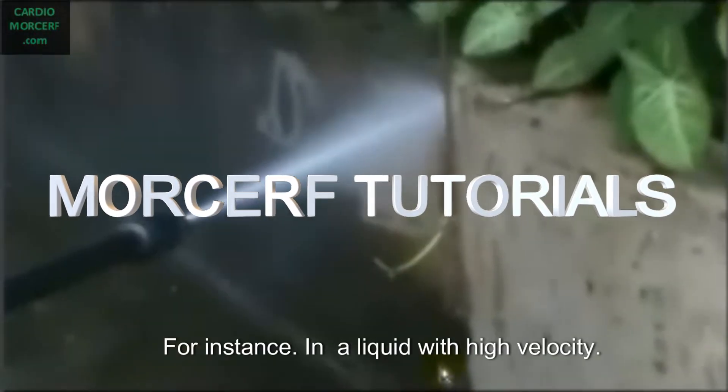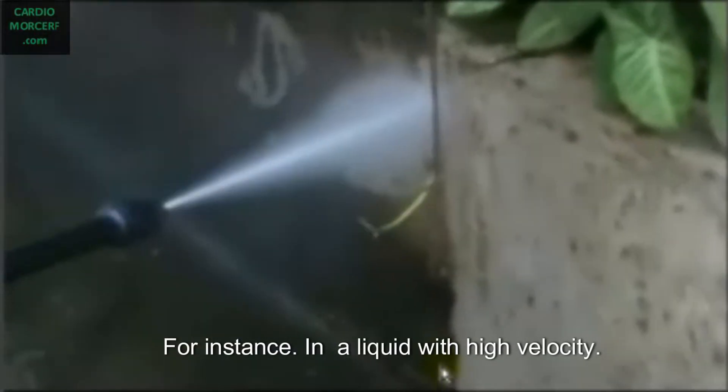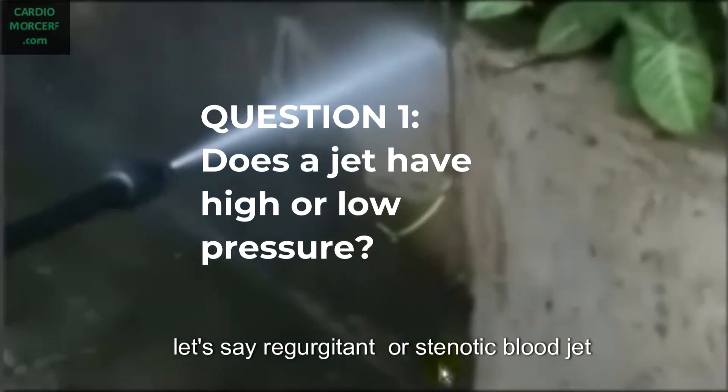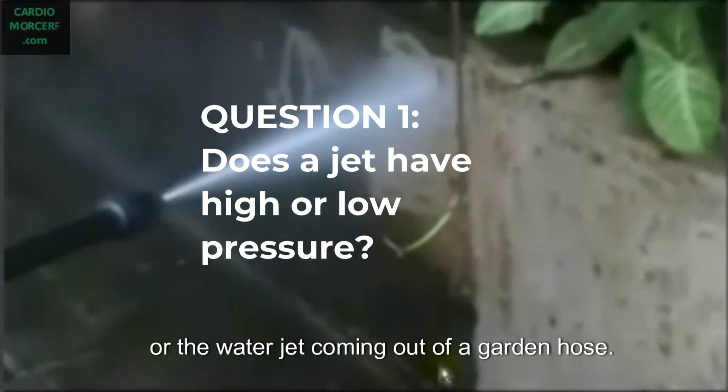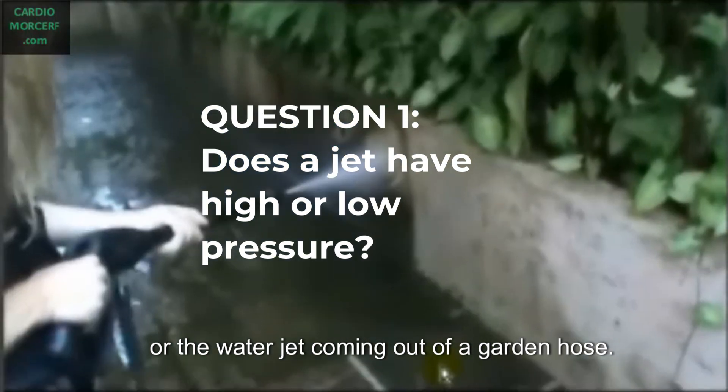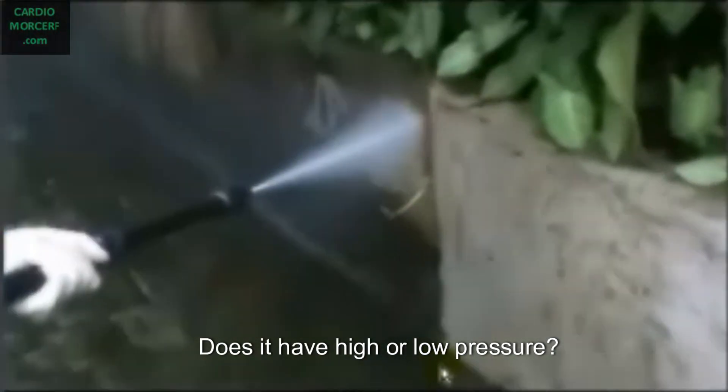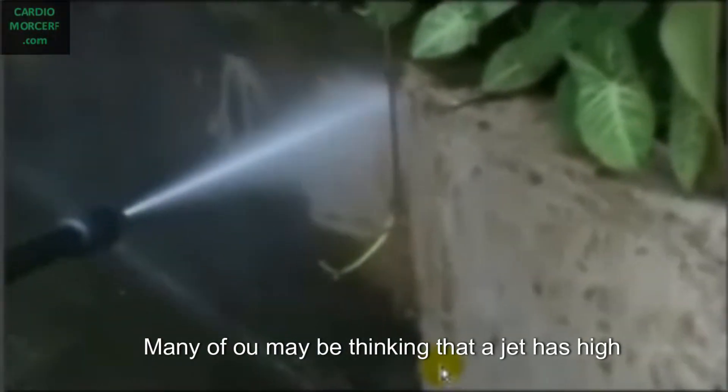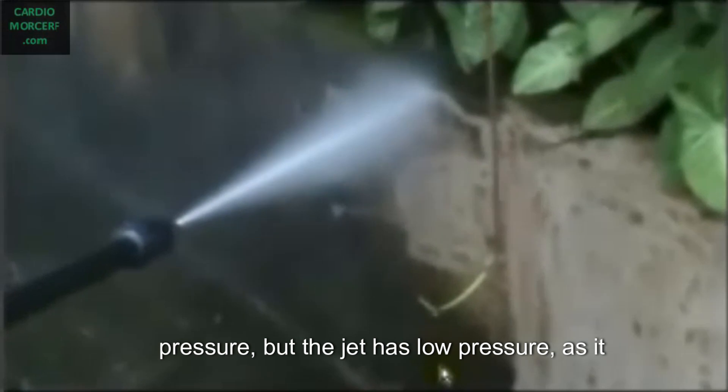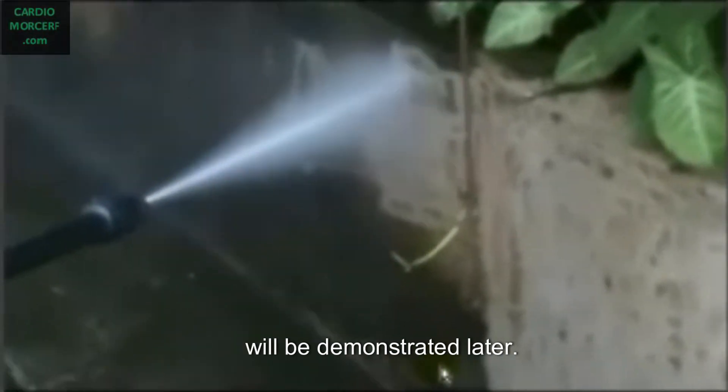For instance, a liquid with high velocity, let's say a regurgitant or stenotic blood jet, or the water jet coming out of a garden hose. Does it have high or low pressure? Many of you may be thinking that a jet has high pressure, but the jet has low pressure, as it will be demonstrated later.